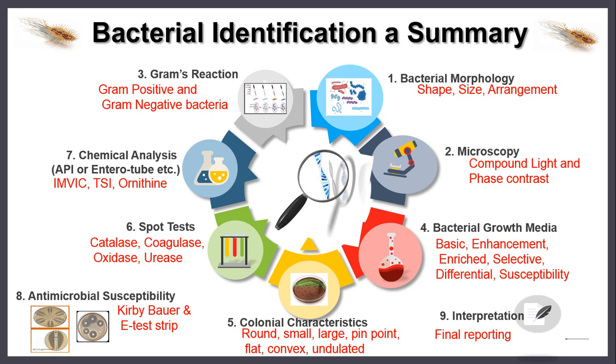the bacterial identification in a routine laboratory, that is, either a clinical microbiology laboratory, a food microbiology laboratory, or an industrial or environmental one. These are some generalized steps that we commonly use to identify bacteria.